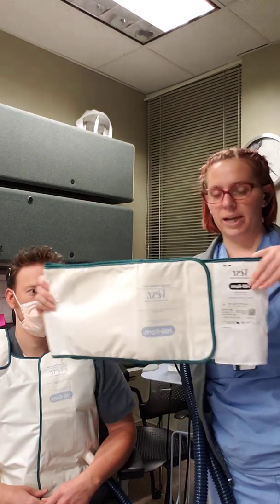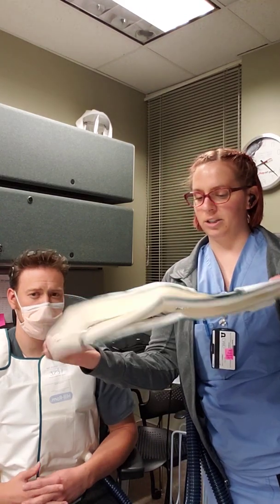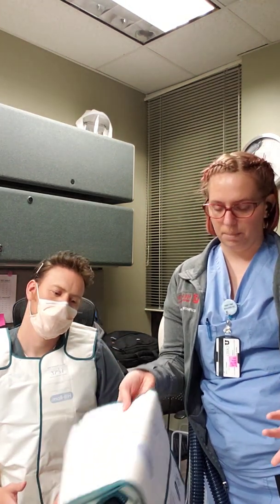The last thing I'm going to say is there are certain vests that are long and just wrap around the patient's chest, often used in ICU situations if a patient is tolerating it or it's indicated. You can also slide it underneath the draw sheet if you have a patient with chest tubes. Most of the time chest tubes are a contraindication, but if you have a patient such as a lung transplant, you might slide it underneath the patient in order to keep those secretions mobilized. So that is CPT and the vest.